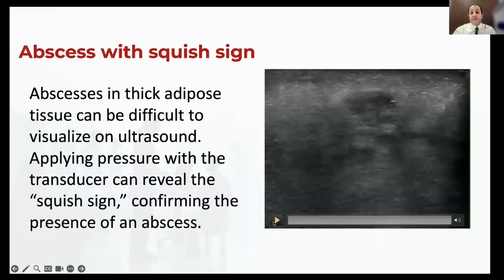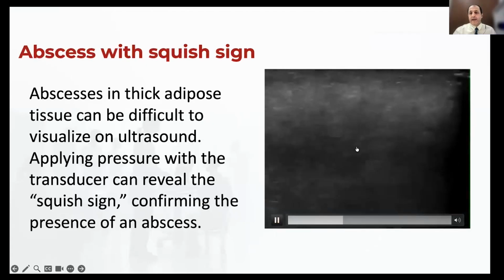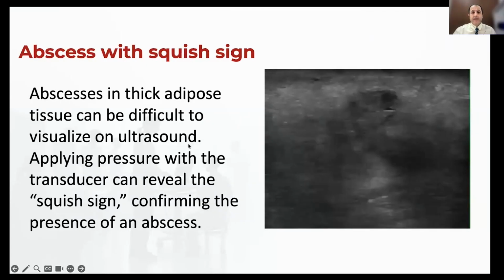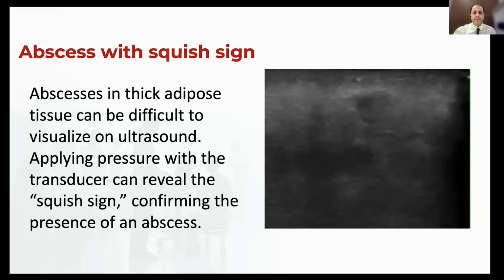Another good landmark that we need to check for in detecting the abscess, when you are not sure whether it is abscess or not, is the squish sign. So when you are putting some pressure on the skin, you can find some movement in the pus. It is the squish sign, and it is a good landmark again for differentiating abscess from other non-infection lesions.